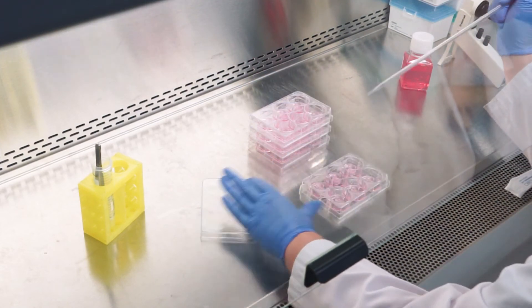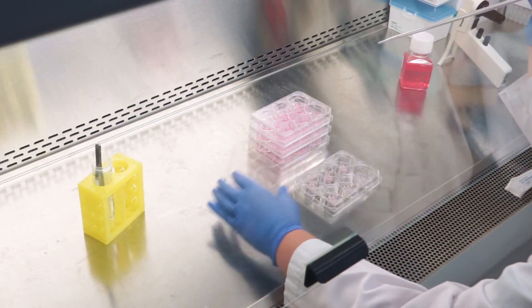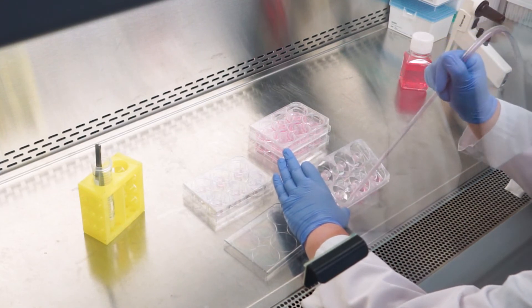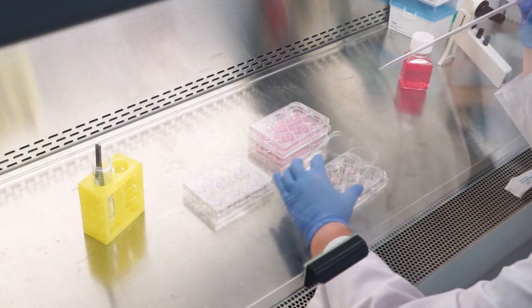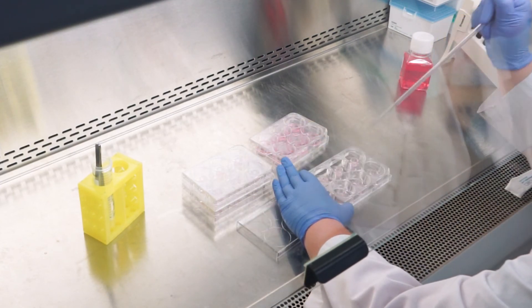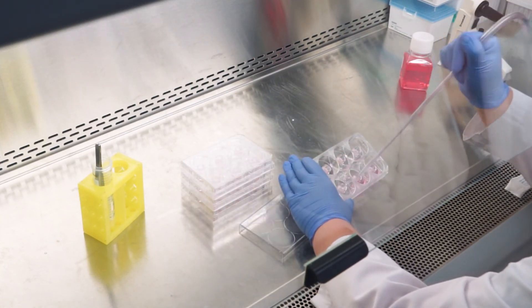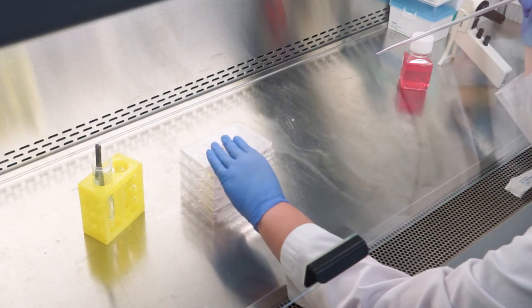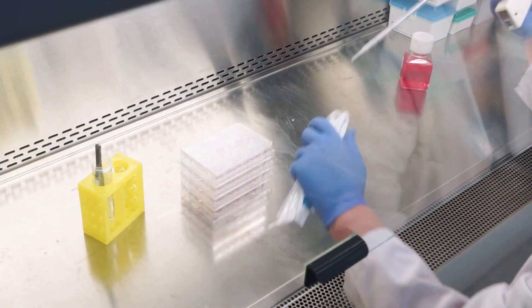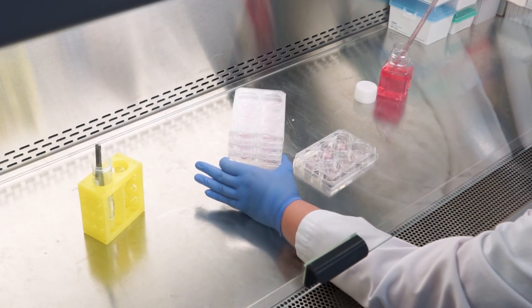At the end of this equilibration period, aspirate the media from each well of the six-well plates containing the EPI 200 tissue inserts and replace with fresh pre-warmed media. Tissue equilibration is now complete and your Epiderm tissues are ready for your experiment.